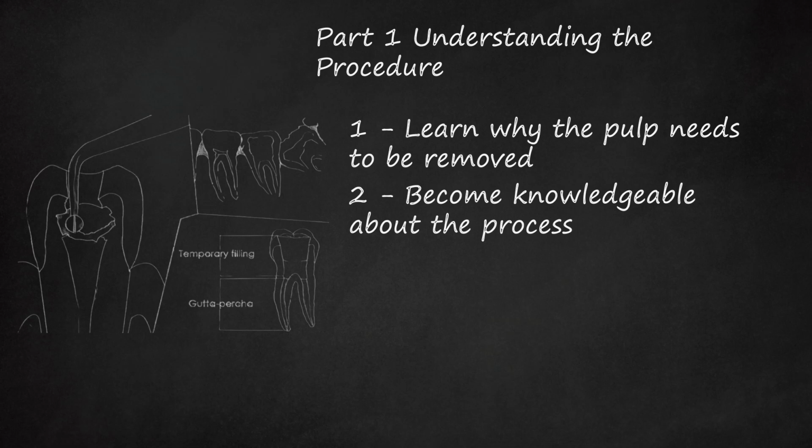Your dentist or dental surgeon will drill an access hole into the tooth. They will then remove the pulp, bacteria, debris, and any decayed or remaining nerve tissue using a root canal file. They will periodically use water or sodium hypochlorite to flush away the debris and disinfect the roots. After the cleaning process is complete, your dentist will apply a sealant. If there is an infection, your dentist may wait up to a week, sometimes 2, to apply the sealant.